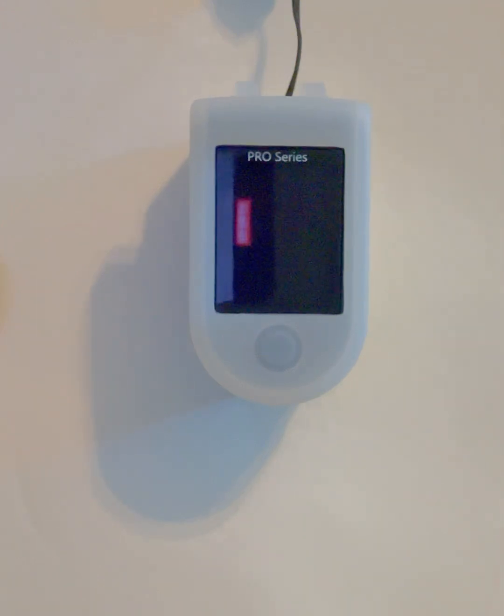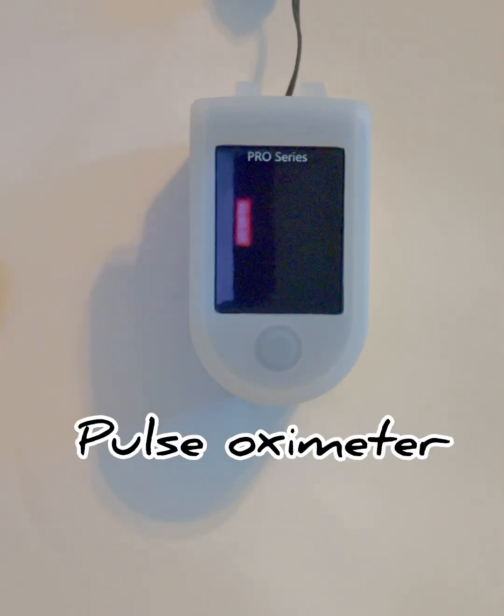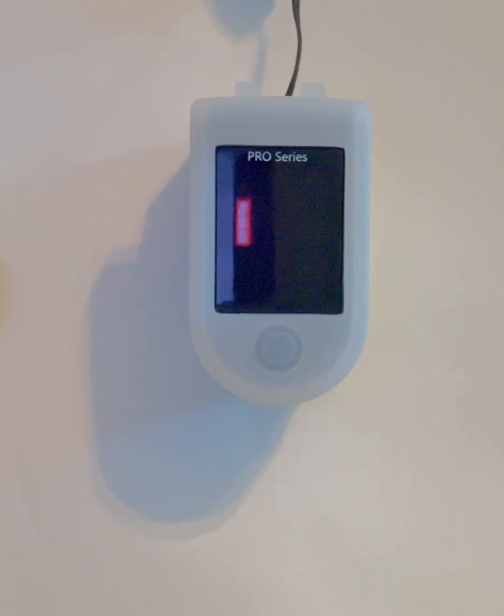Do you want to check your oxygen levels at home? A pulse oximeter is a quick and simple tool you can use to measure how well oxygen is being sent to your body. In this short video I'll show you exactly how to use a pulse oximeter, what your readings mean, and tips for getting accurate results. Let's get started.